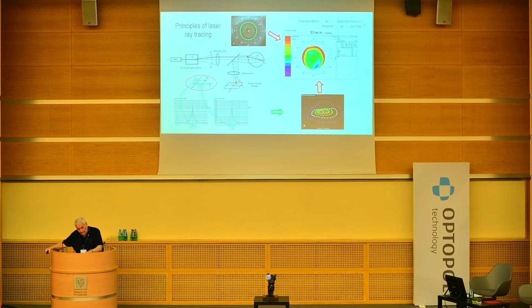On the black quadrant on the top, you see the points of entrance into the eye. They are regular points in several circles, outer circle, internal circle, six circles with the points.